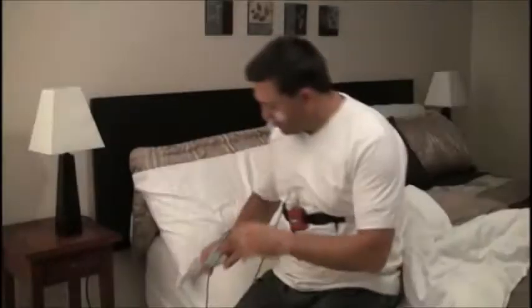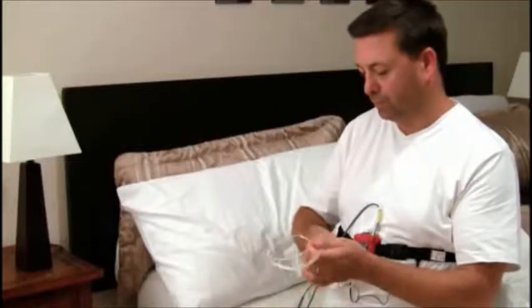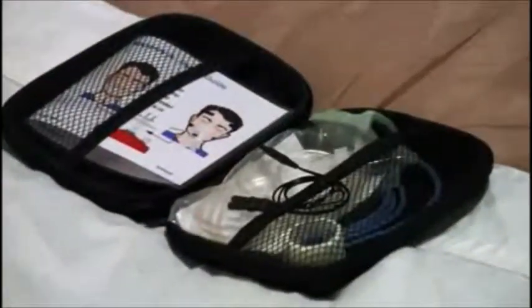You are now ready to go to sleep. When you awake, simply disconnect the sensors from the unit. Disconnect the unit from the belt and return all pieces of the unit to the package. Return the packaged Metabyte system according to the instructions.